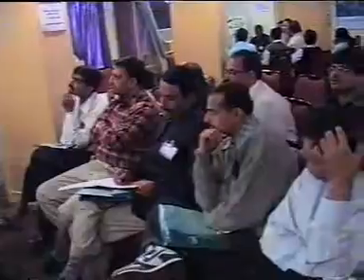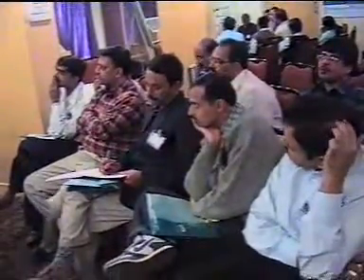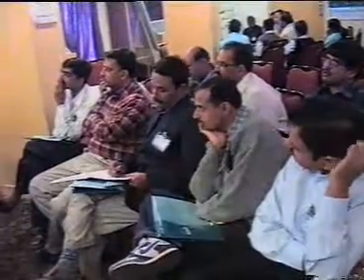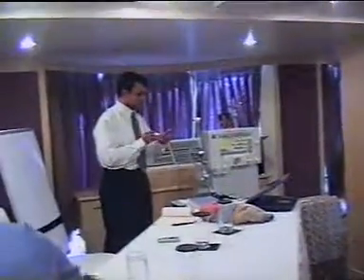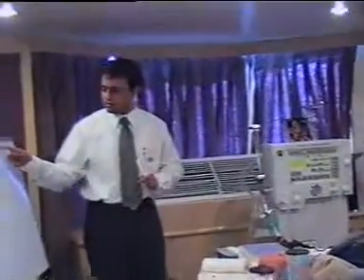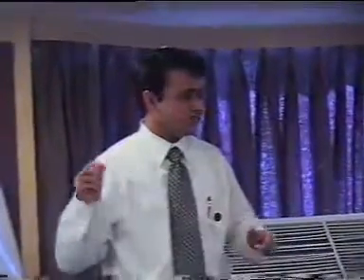So we're using two gas sources and they are going to deliver at a certain amount of pressure, and the pressure setting is 50 to 70 pounds per square inch, which you can see on the posterior of the ventilator, I'll show you subsequently. This oxygen and air drives the piston of the ventilator. This is actually a piston.